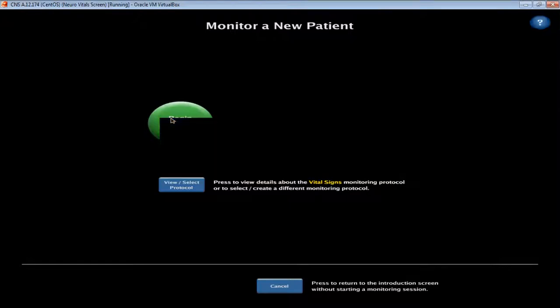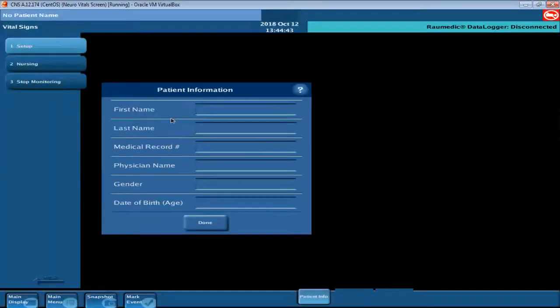Typically, when we are on site for training, we will give your educator or whoever is your project lead a copy of your protocol as it was originally written, and they keep that on a thumb drive. So usually we will ask them for a thumb drive, we will import the protocol to their thumb drive, and they keep that as a pure copy.